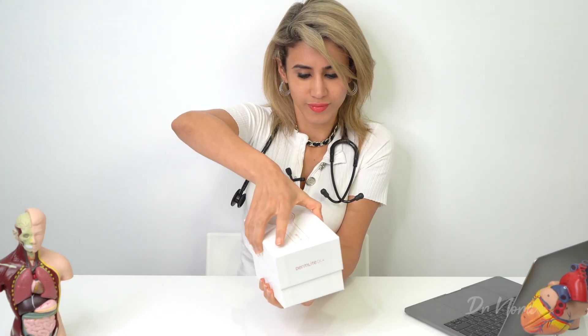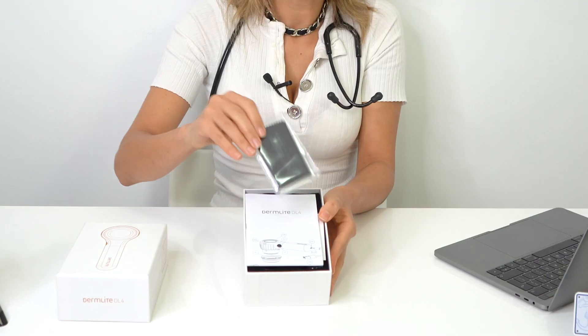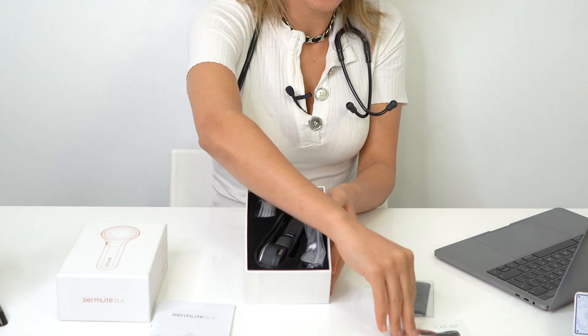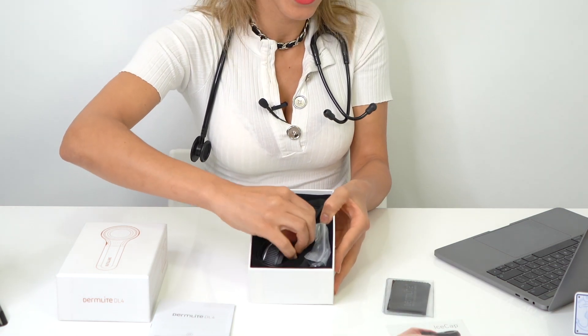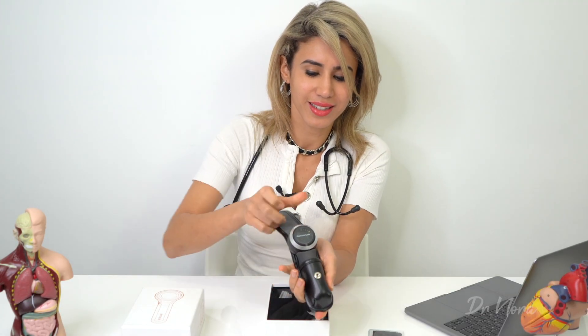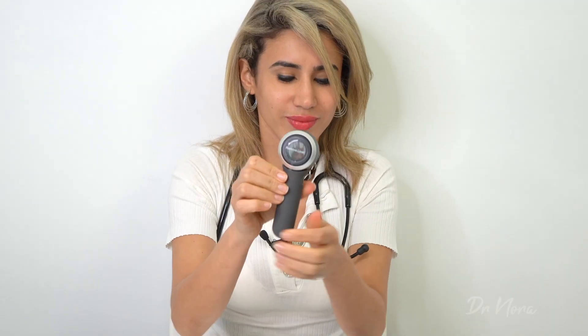So with me here I've got the Dermlight DL4 — let's take a look inside the box. Inside you get a lens wipe, an instruction manual, some lens caps, and of course the pièce de résistance: the actual dermoscope itself, which comes with its own leather carry case and that beautiful handheld device. Additionally you get a USB charging cable which you can plug into your computer to charge it on the go, and some disposable ice caps which are vital to prevent cross-contamination between patients — you place these on your dermoscope and then chuck them away after each patient.